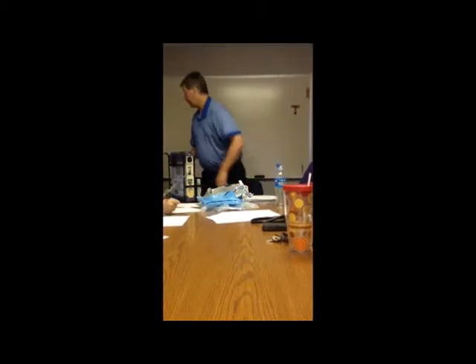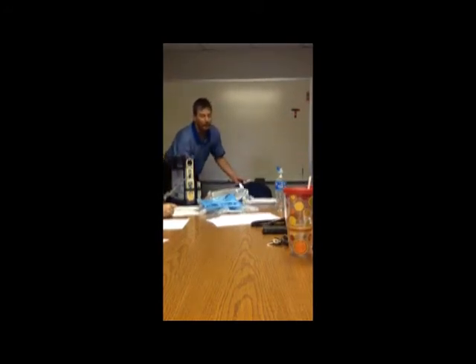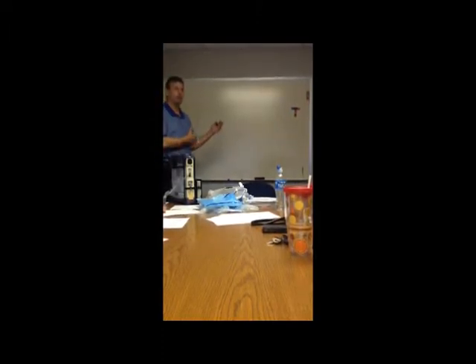And I'm going to draw some stuff up here right quick that'll help us with this. All right, this part of the scale is pressure on this waveform. I know y'all don't use waveforms, this event doesn't have it, we use them religiously in the hospital. If you ask somebody to describe what is a breath, you can't see a breath. You have to find a way to draw it to compare them. So what I'm going to draw is the pressure that's generated by the breath, and I'll explain it a little bit more in a second.